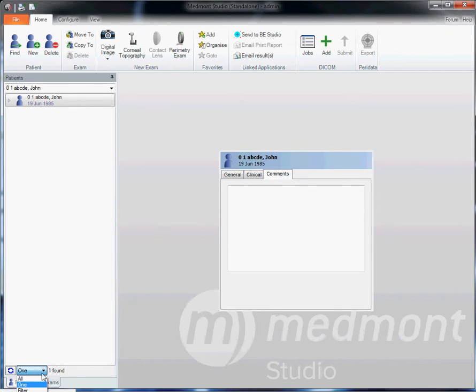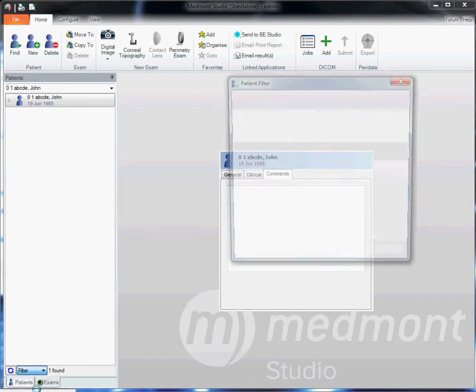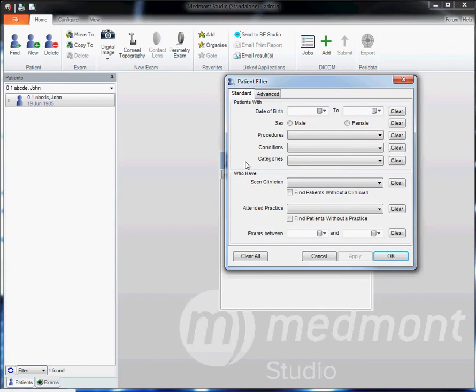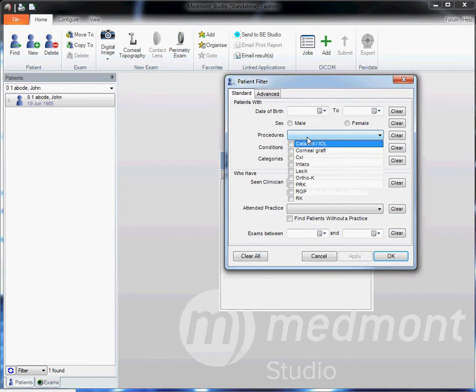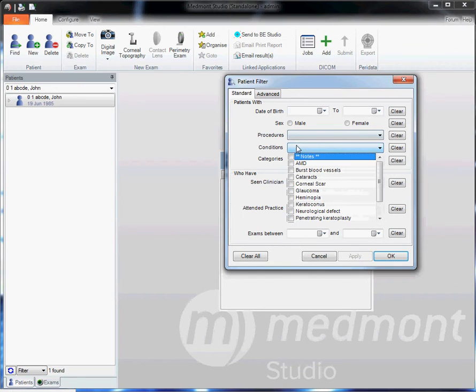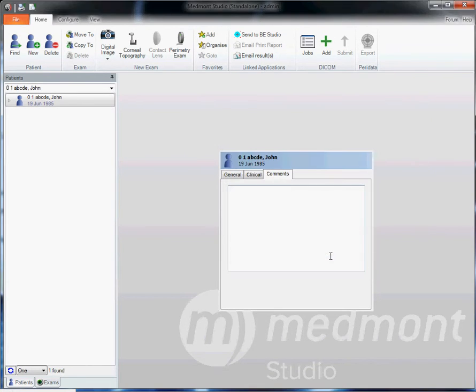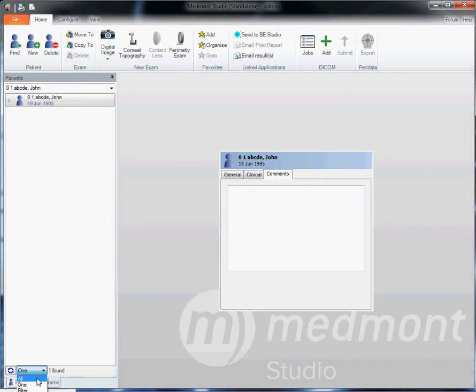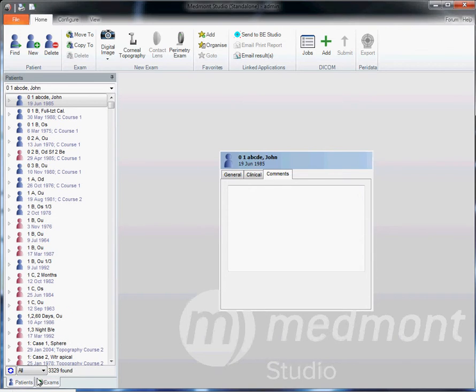If you'd like to do a filter to search for all the patients with specific procedures or conditions, you can do that here. If you want to go back and show all of your database, click on the pull-down menu and all.